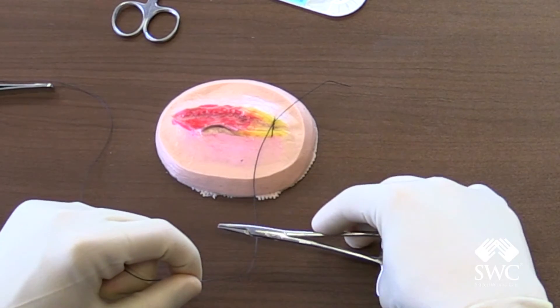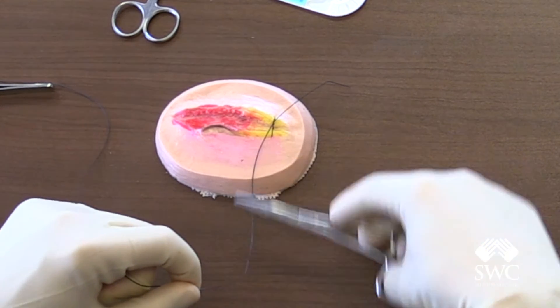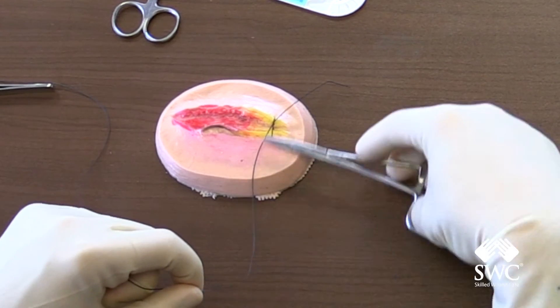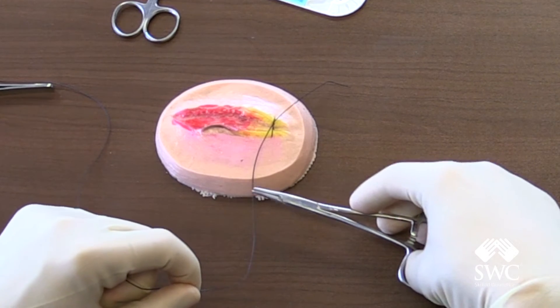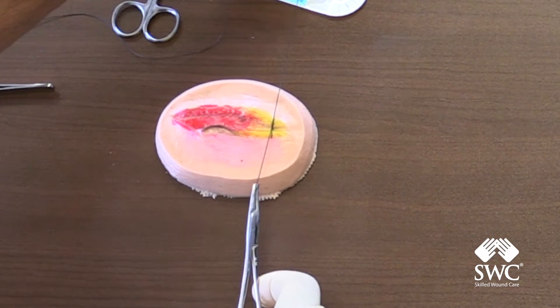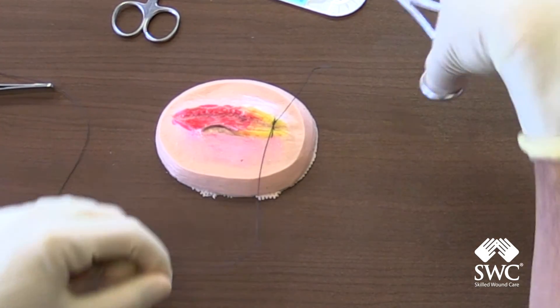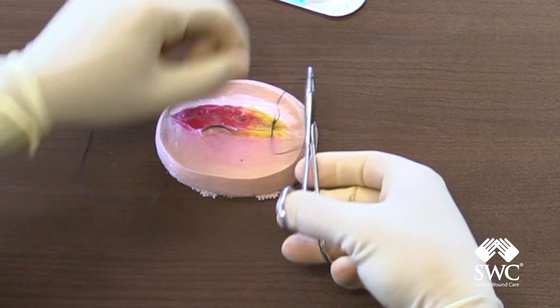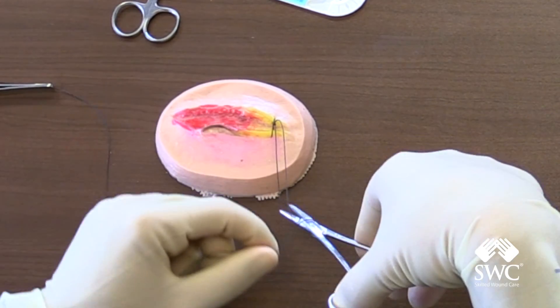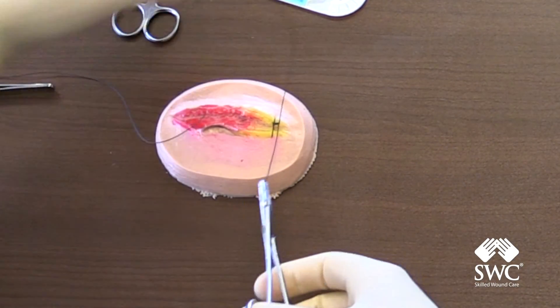You're going in again — if you can see here, you're going in between the tail and the suture, and the needle side of the silk suture, and you're doing one wrap, and then cross hands. Every time I'm inside, crossing hands. And there you have it — that is an instrument tie.